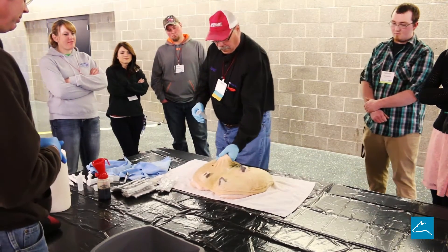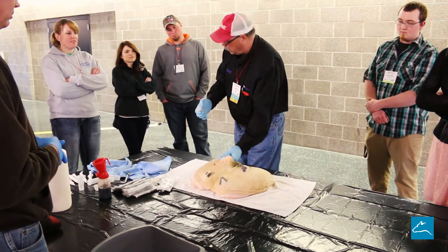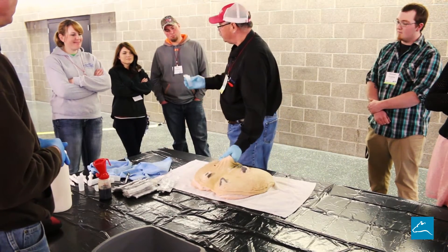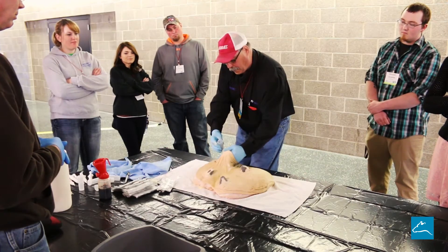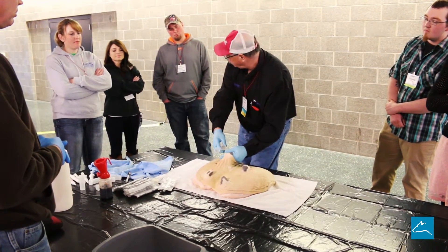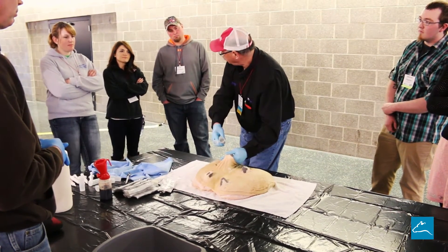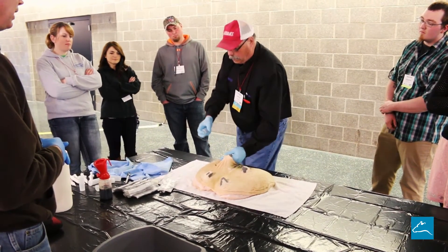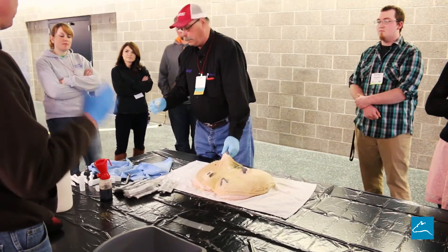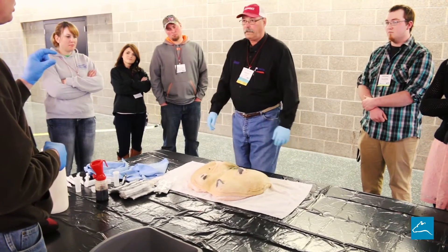Upside down, flip the top. I know you guys have done this many times, but it's just a review. If this were upside down, I tilt it this way to try and squirt in, so I don't get debris falling off the teat. You don't need to have that thing clear full to the top — a third full is plenty.